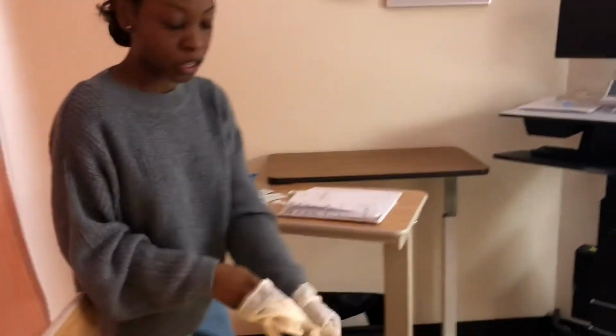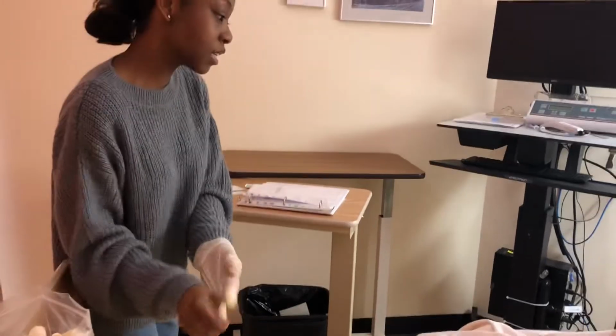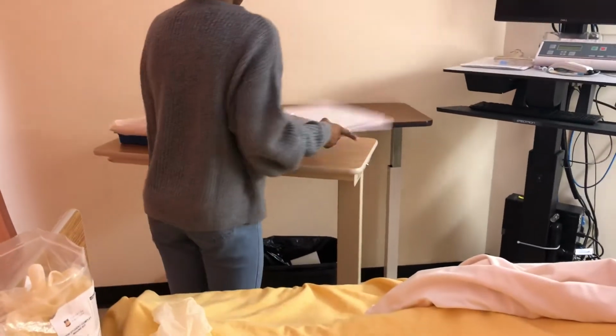10 minutes left. 10 minutes, okay. So I'm going to go ahead and open my dressing tray and do my dressing.